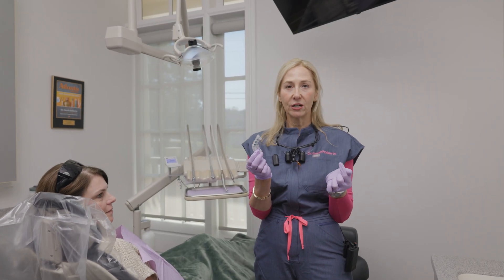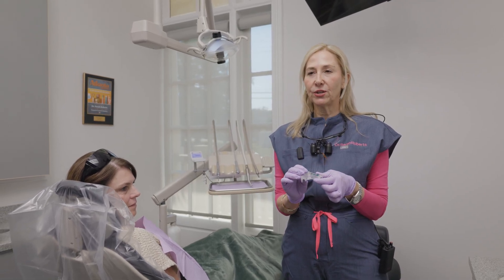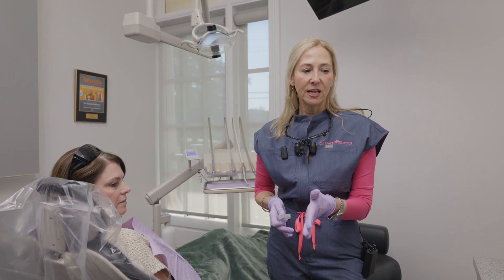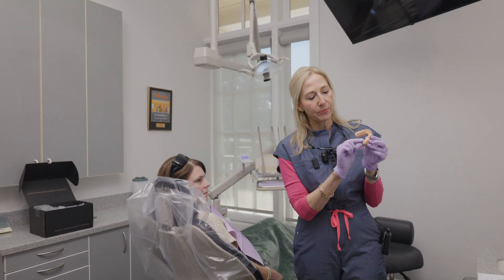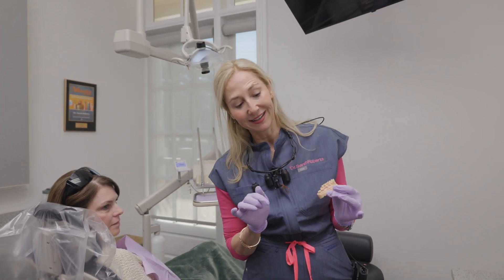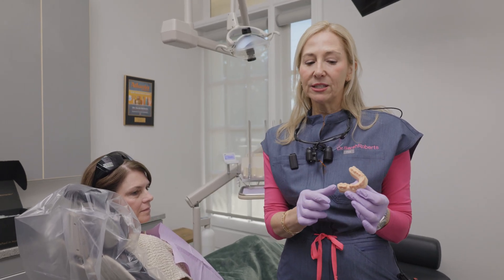I have a surgical guide here, and the purpose of it is to enable me to put the implant in the most precise position. Traditionally, dentists would make an incision in the jaw, pull the tissues back from either side to expose the bone, and then eyeball where the implant was supposed to go. The problem with that is sometimes it wasn't in the right position to put a tooth on it and have it look nice.